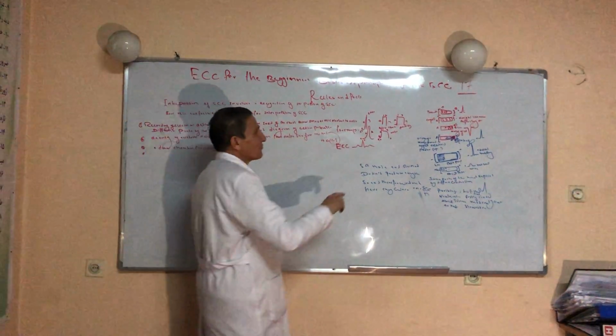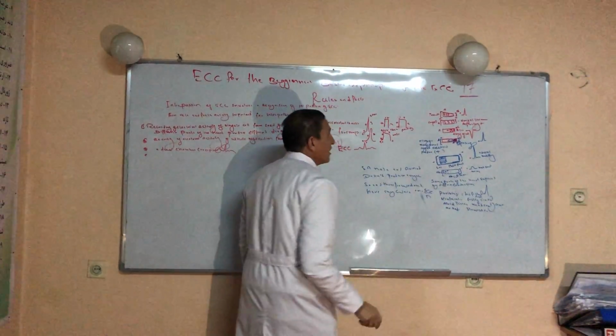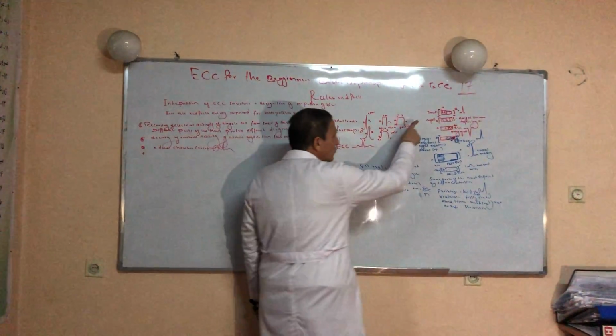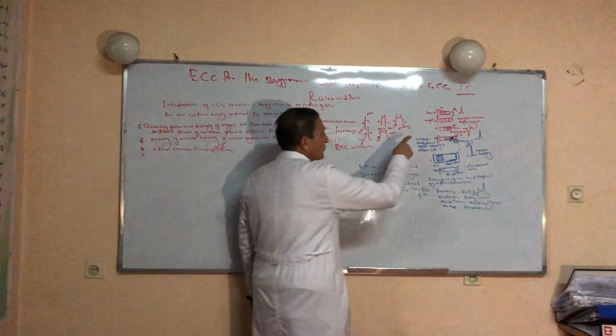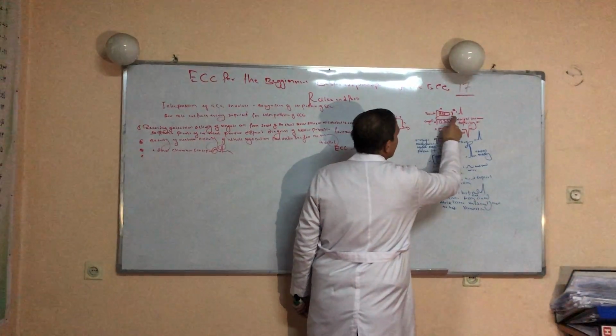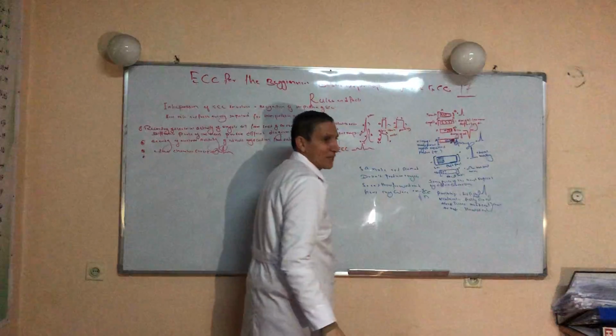After the dual chamber concept, we are coming to these illustrations. Remember, a positive charge, when it moves toward the electrode, produces a positive deflection. It is very important: when a positive charge moves toward the positive electrode, the deflection in the needle would be positive. This is very important.